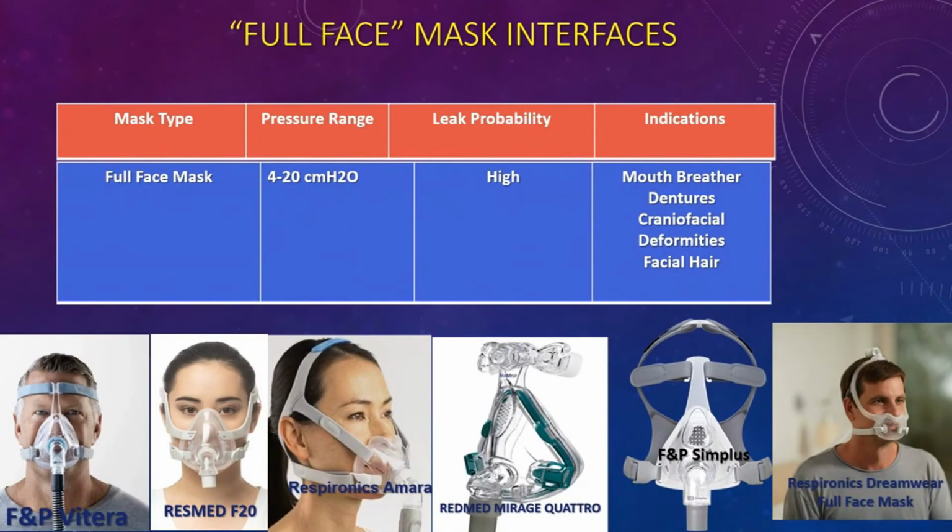The full face mask is a type of mask that allows the patient to breathe both through their nose and through their mouth. The original full face mask was designed and produced by ResMed in the mid-1990s.